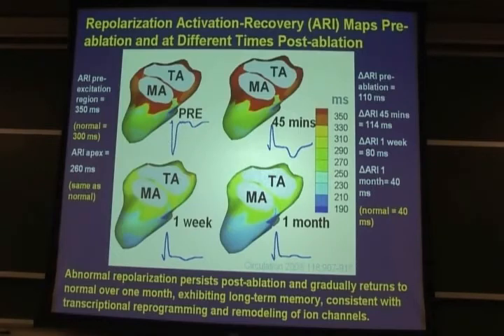So the distance between them in time, this interval, is activation recovery interval. Now, on the electrogram, activation corresponds to the rising phase of an action potential underneath this electrode, and the T wave corresponds to the downslope or repolarization of the action potential. So activation recovery interval is a good surrogate of the action potential duration at that location.